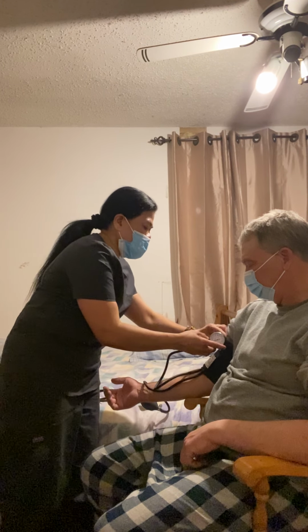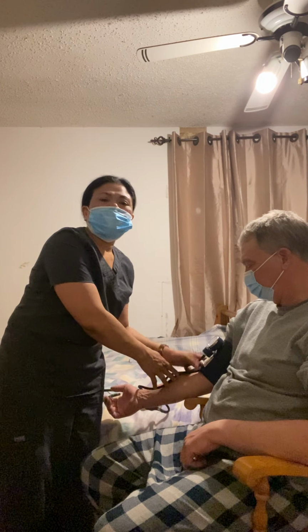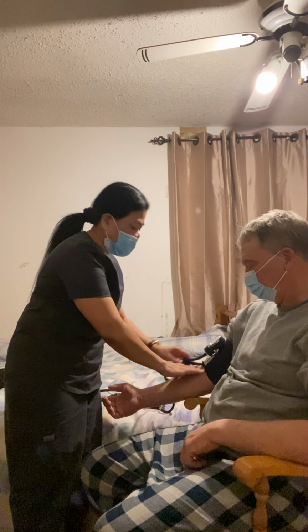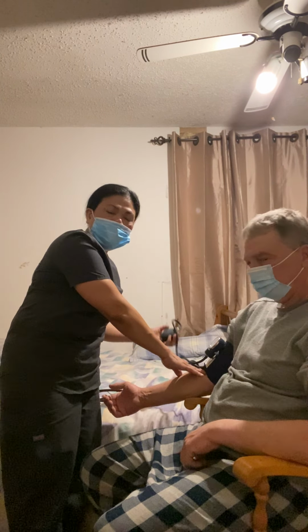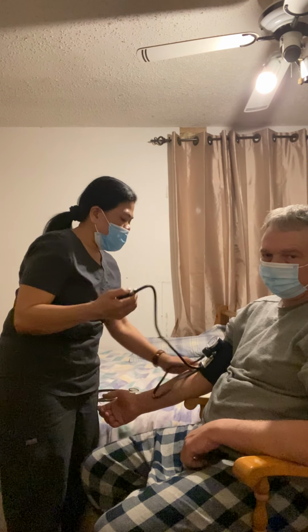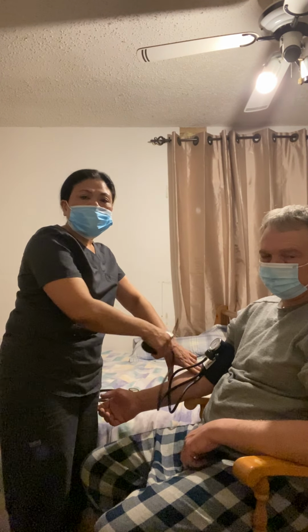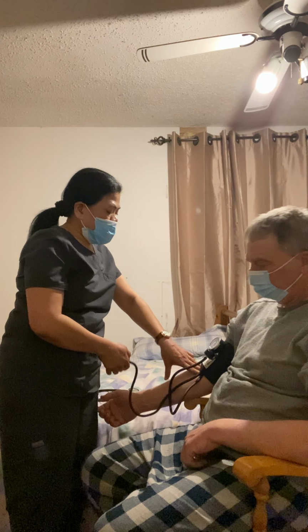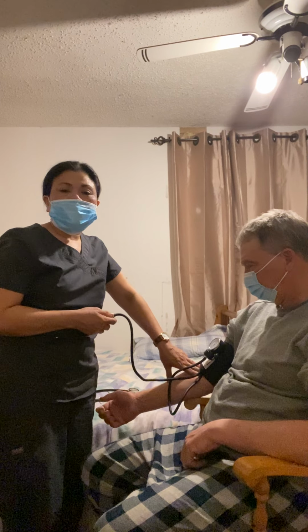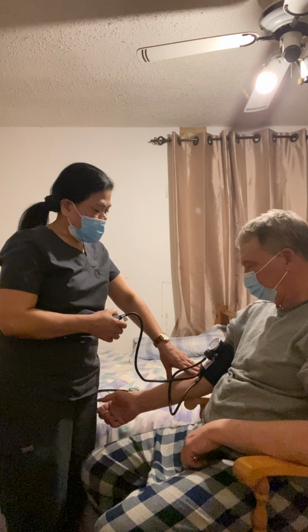And then first we're going to estimate our systolic number. To do that, we're going to palpate the brachial artery here, and then inflate our cuff, taking note of the gauge and the number until we don't feel the brachial artery anymore, because that's going to be our systolic number.